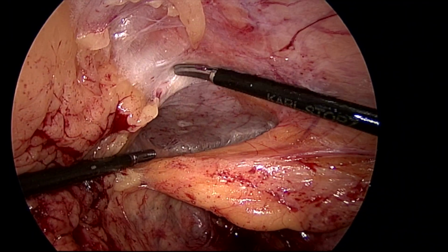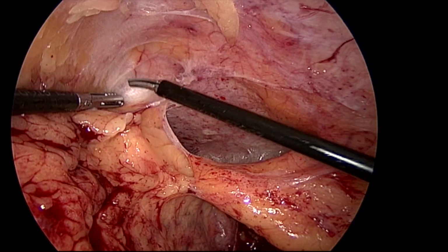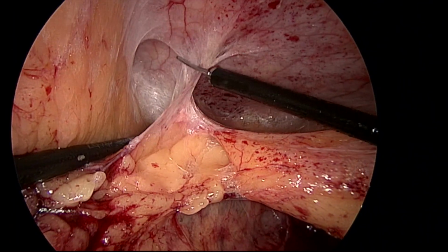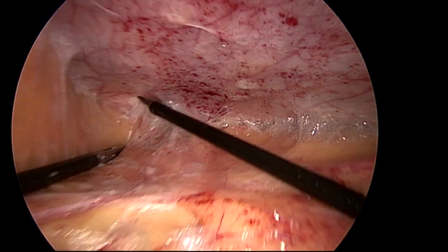So all the omental adhesions are being released. Till I'm able to see the liver, I'm releasing the omentum from the falciform. Thick omentum is advantageous. Otherwise, bowel adhesions will be there. The colon will be adherent here. So I'm releasing that omentum from the intra-abdominal wall.